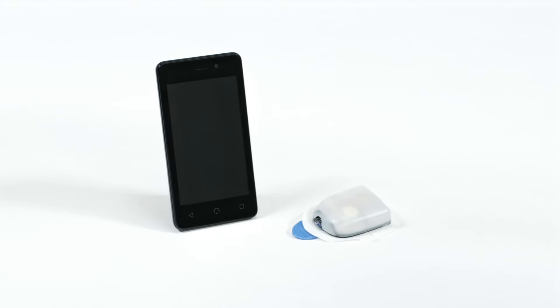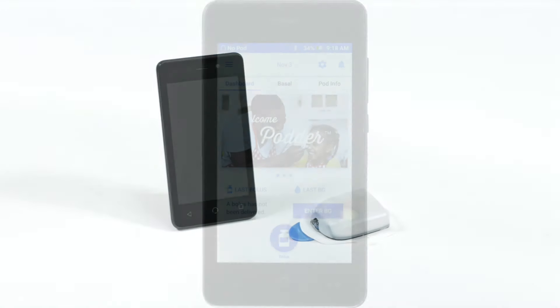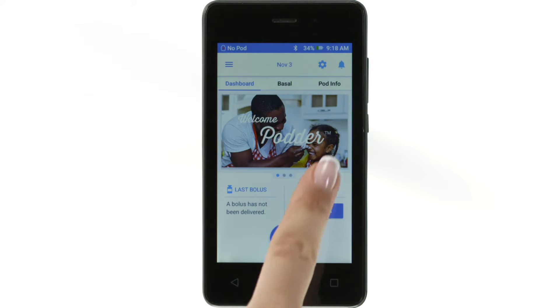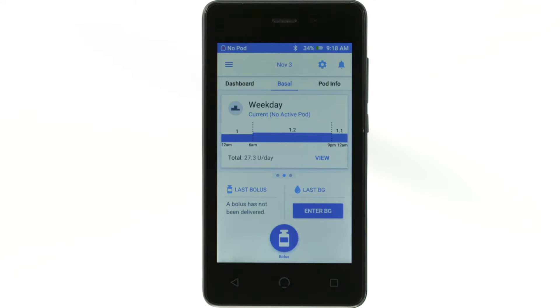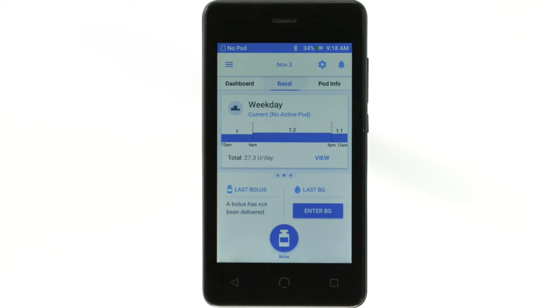The PDM controls all the pod's functions and has a touchscreen, similar to a smartphone. The home screen has three main views: dashboard, basal, and pod info. There are two main actions you'll perform when navigating the Omnipod PDM: tapping and swiping.